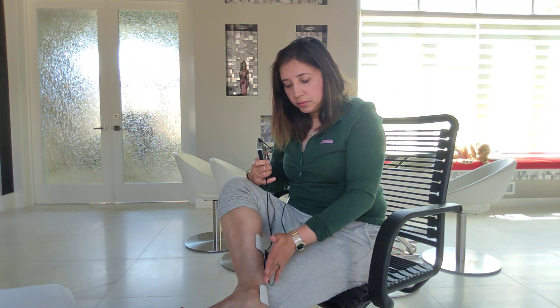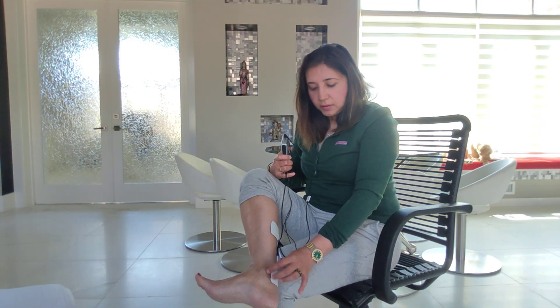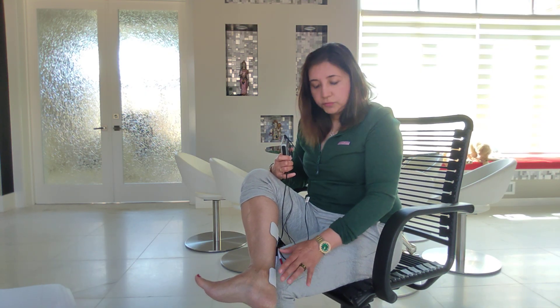For the placement of electrodes, you want to find the bony bump on the inside of your ankle — it's called the medial malleolus. Once you find the bump, place the first electrode just behind and slightly lower to the medial malleolus.